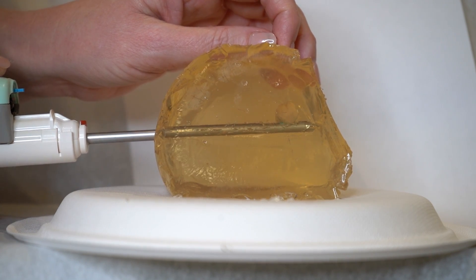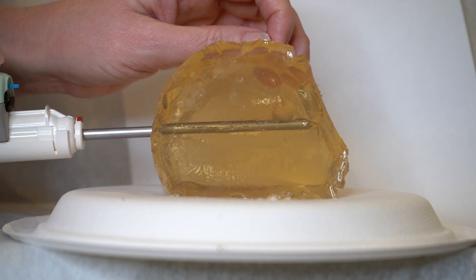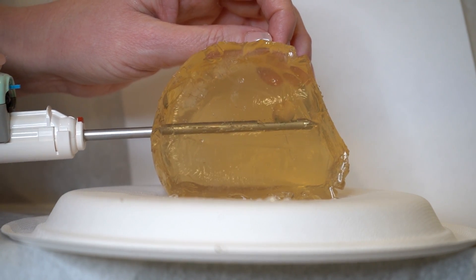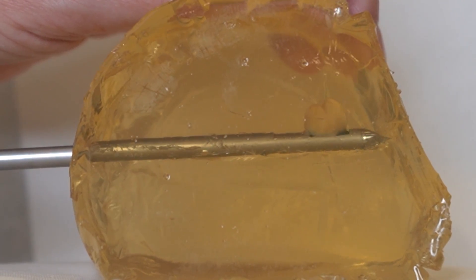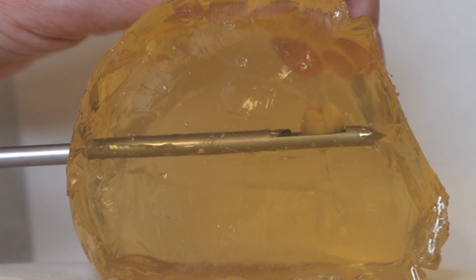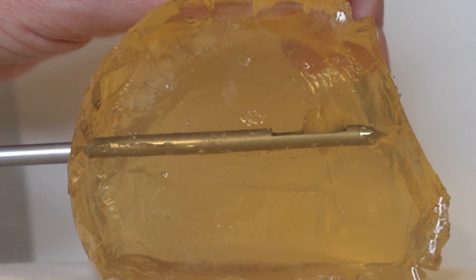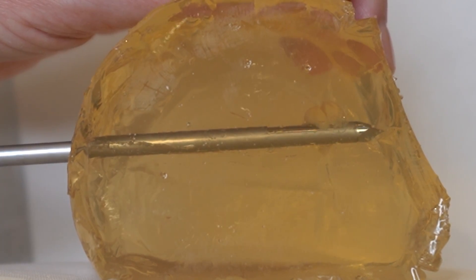We do this over and over again, and with our ultrasound guidance we look around to see if there are any small bits of the area that we haven't addressed with our biopsy device. The tissue is pulled out into a collection chamber, and then once the tissue is pulled out we pass that off to be analyzed under the microscope to make sure that all the cells are safe and healthy.